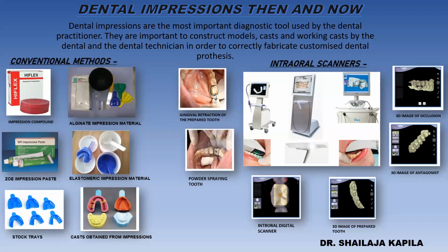As a relatively new technique, the deficits in repeatability of the intraoral digital impression need to be solved, but dental products fabricated with intraoral digital impressions have presented accuracy on par with conventional impressions. Although conventional impression materials like polyvinyl siloxane and polyether were developed and present great accuracy in many prostheses, the intraoral digital impression technique has a distinct superiority in work efficiency and saving of materials. The further improvement of the intraoral digital impression technique will lead to its wide use in dentistry.